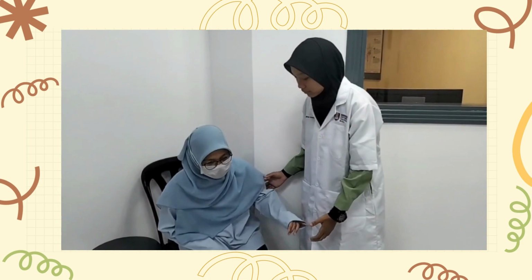My ID number is 040715100352. Okay, that's right. When is the first day of your latest menstrual period? Yesterday. Okay, that's okay. So then we're gonna change your clothes into the hospital gown, and the opening is at the back. Okay. And that's all.